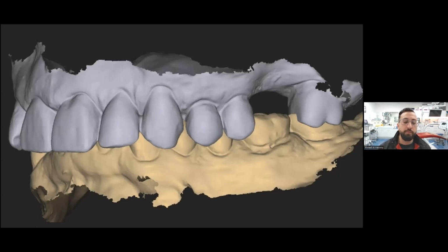And my advice to you in these cases is, usually the maxillary arch aligns very easily to the bite scan, but the mandibular arch, you're constantly scanning and it is not aligning. And in those cases, I even tilt the scanner almost facing upwards towards the occlusal table, trying to capture as much data as I can of those crowns underneath the buccal cusps of the upper molars. And so you can do all sorts of tricks like that.